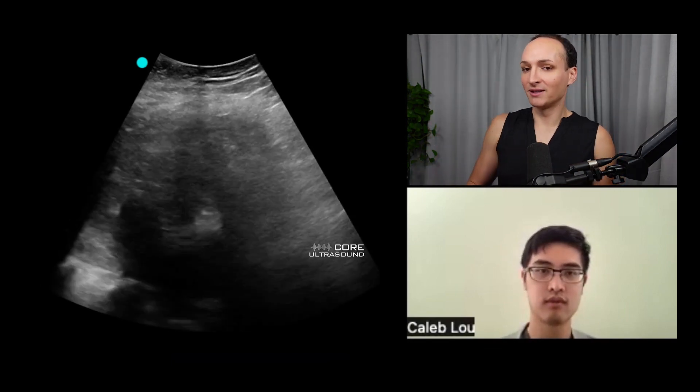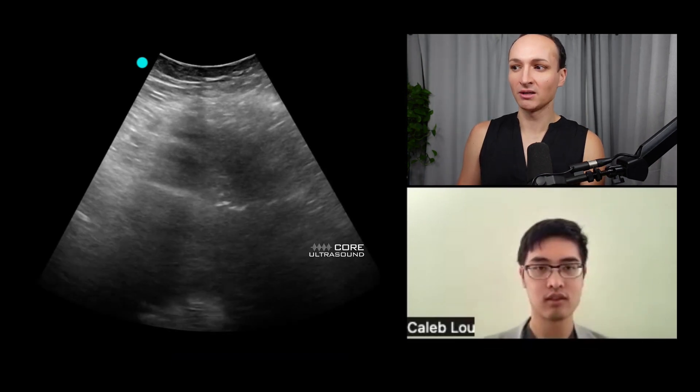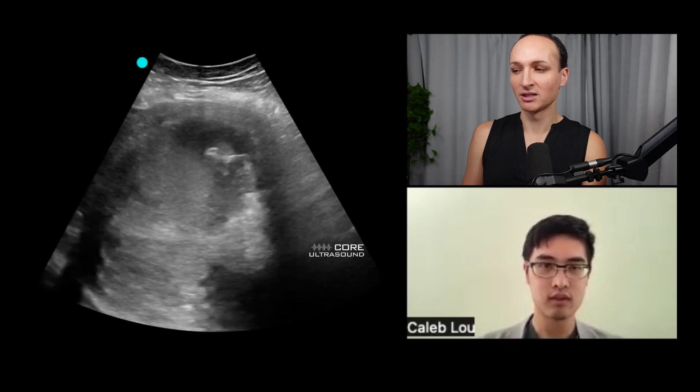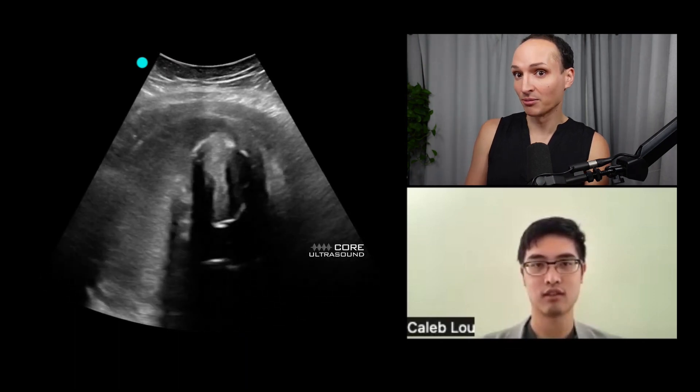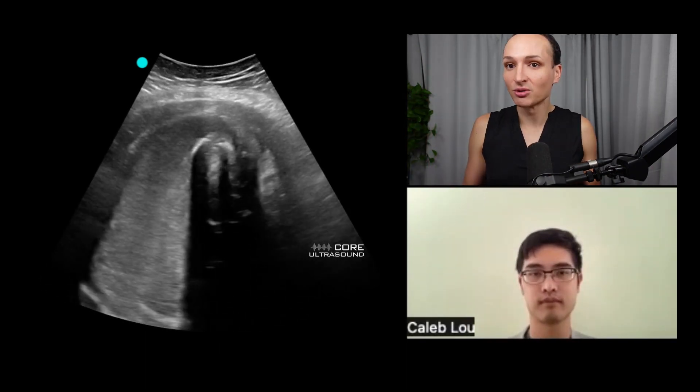I'm looking at the uterus of a patient who came in with pain and had a history of fibroids. Look at that shadowing — is it a dirty shadow of gas or a full dark shadow? It's calcification in the setting of fibroids. Not all fibroids calcify, but severe longstanding ones can calcify like this. You can see the whole uterus is quite enlarged. It's just good to know what fibroids look like on ultrasound — and that's a great thing about ultrasound, we can basically look at whatever we want.